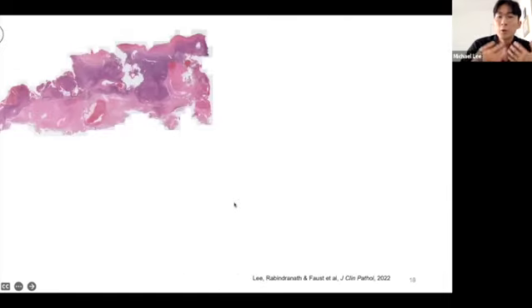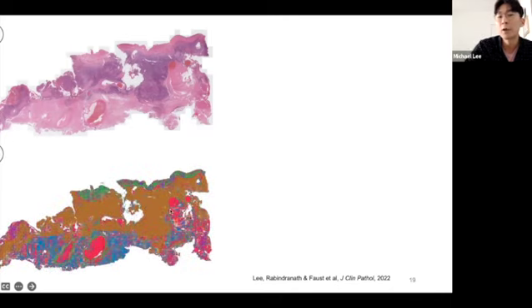And how we wanted to use SIFT in our workflow is essentially to do focused analysis on specific regions of the whole slide image. So when we look at this, this is the original H&E stained whole slide image of a glioma. And after running it through the first step, the histomorphologic classifier, we can generate this heat map.